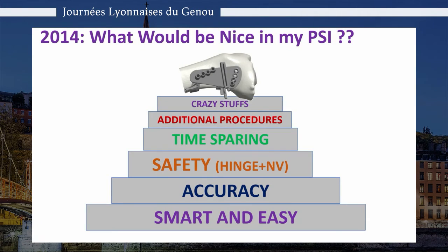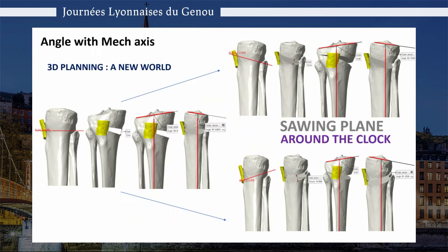What will be nice when using a PSI? This was the question we asked with Sebastian Parratte in 2014. Of course, it should be smart and easy, accurate, provide us safety, give us some time sparing, and probably help us to do additional procedures when doing osteotomies.